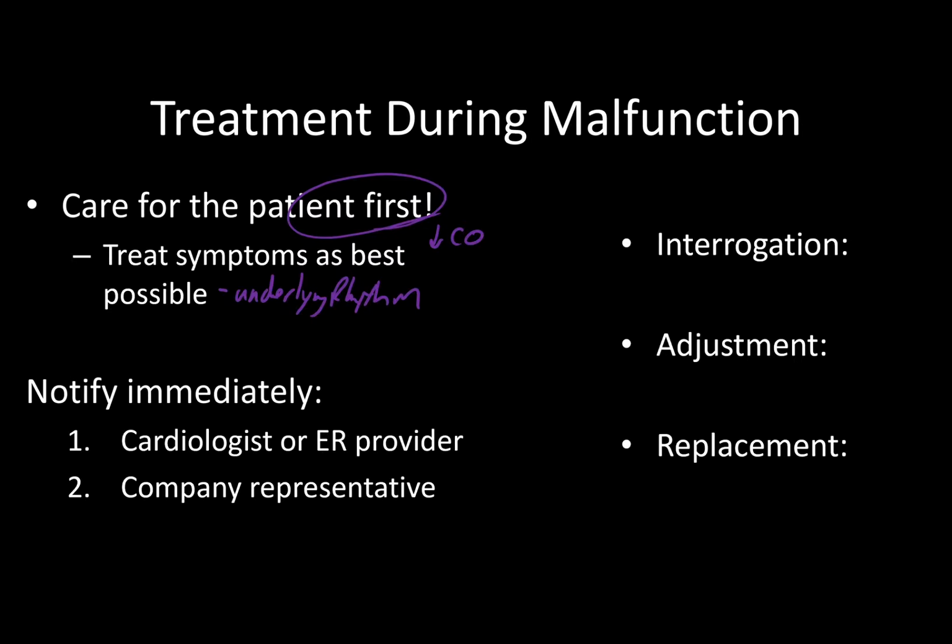If you think about it, pacemakers are the treatment. They wouldn't have a pacemaker in place if they didn't already have something pre-existing wrong. So if they've got a severe bradycardia, we gave them a pacemaker as the treatment. Now if they have a new problem, we need to do whatever we can for that scenario and not say, oh, the pacemaker is broke, let's fix that first.